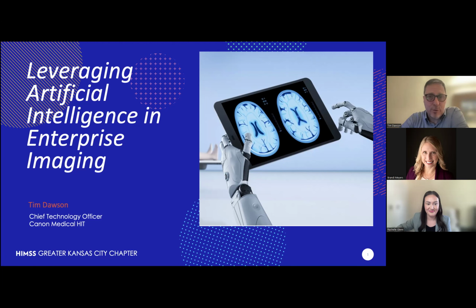The radiologist does have to look at the images. Even in a stroke case, there can be early care and things like that done. But what needs to happen is the radiologist needs to sign off and read the report first before certain things progress. Same sort of thing happens with AI.